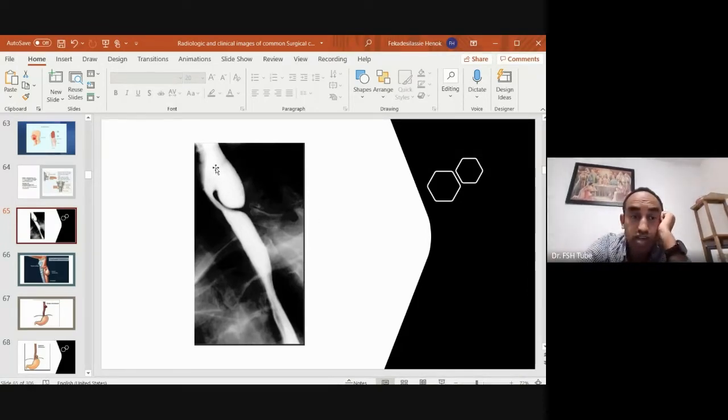At the neck, blockade, compression, do you see? This diverticular sac is full of the contrast. Whatever the patient is swallowing, it could be fluid, food, or saliva, is collecting in the diverticular sac. Then, due to the effect of gravity, it rests on the distal segment of the esophagus and pushes it externally. You see how the esophagus is narrowed here, which causes the dysphagia because the sac is loaded with food, debris, fluid, saliva. It pushes by external compression. That's why it's smooth, the esophagus doesn't have any rugged surface, because it's external compression.